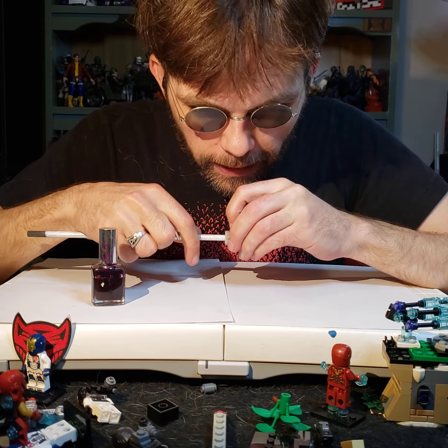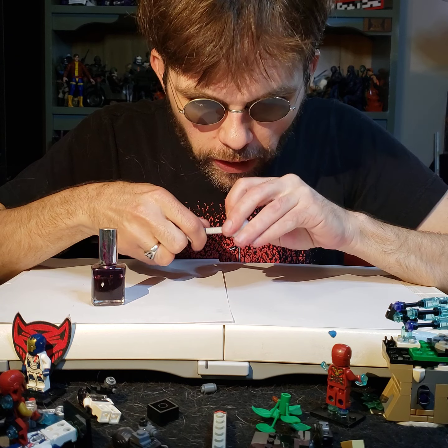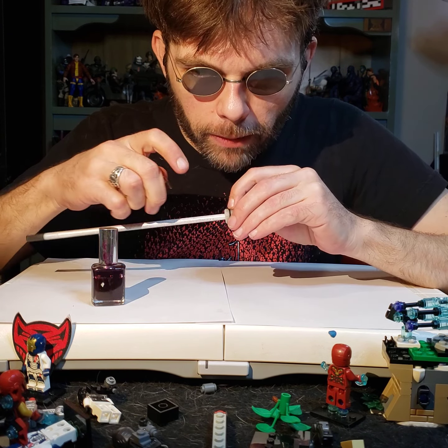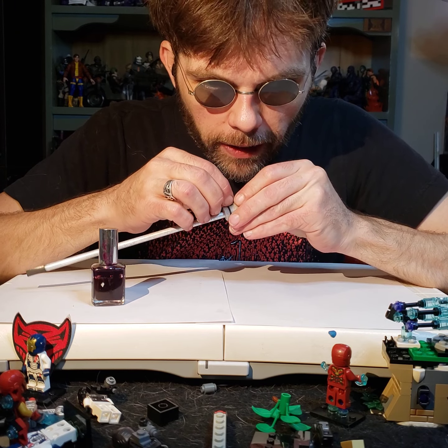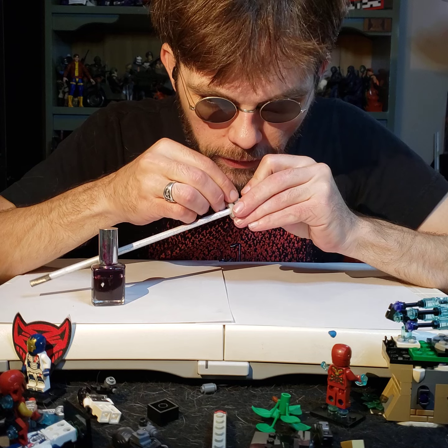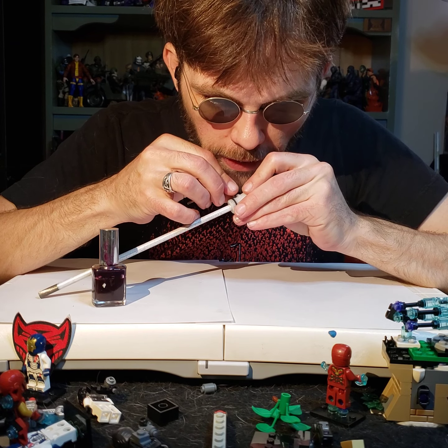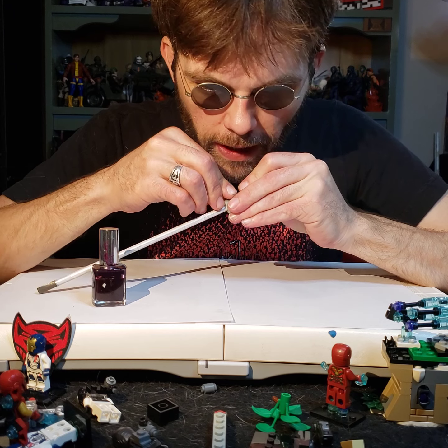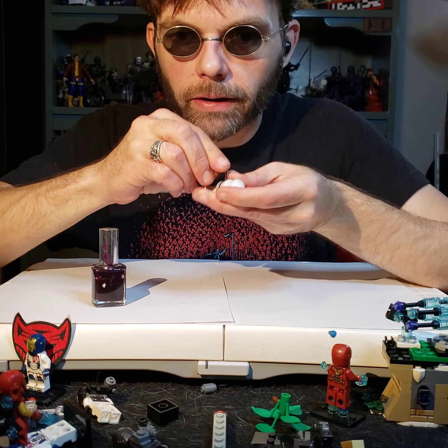We're going to find the place where we're supposed to screw the Allen wrench into, and it may be difficult to find it, but this is a Teflon tip, and it's the only rough bit on the side. So once you find it, you got to then figure out how to line up your Allen wrench. You know, blind people, stay with me right now. You know it. I know it. Lining things up is not the easiest thing in the world.